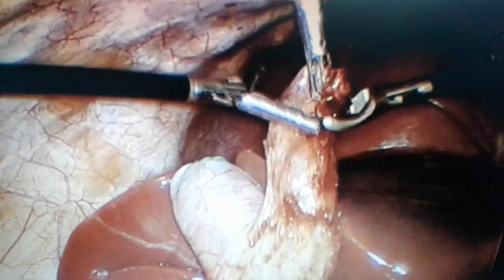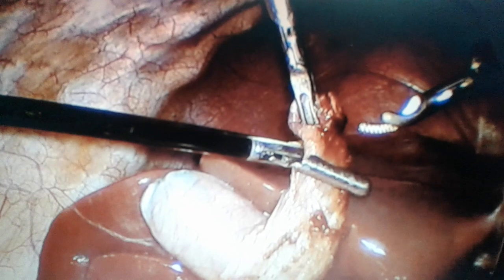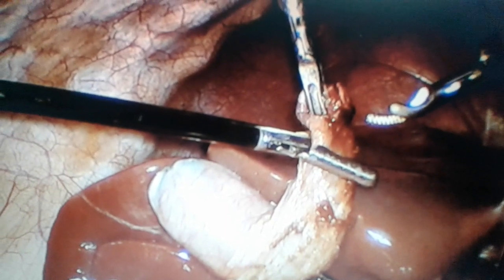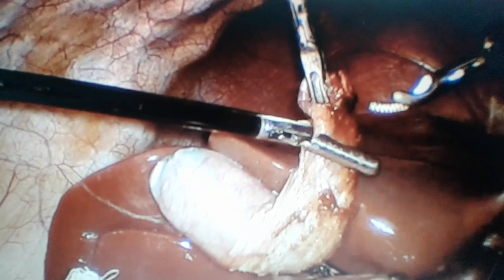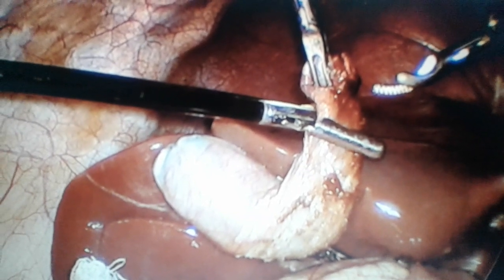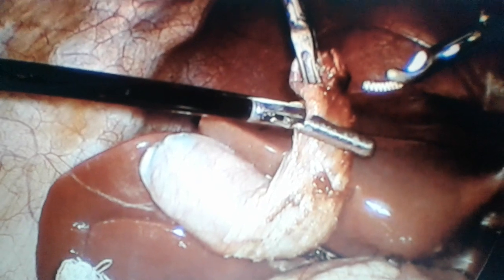At this point, what we can do is either ask your assistant to hold this cut end of the gallbladder, or we can apply another clip if possible and continue our dissection. Let's see.